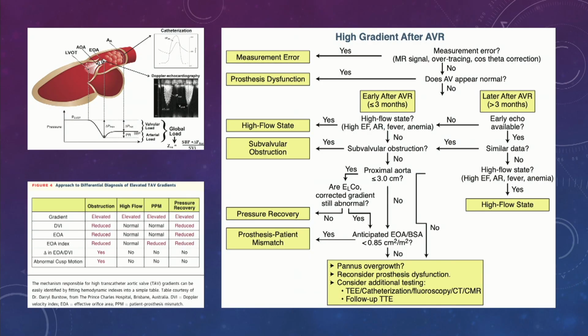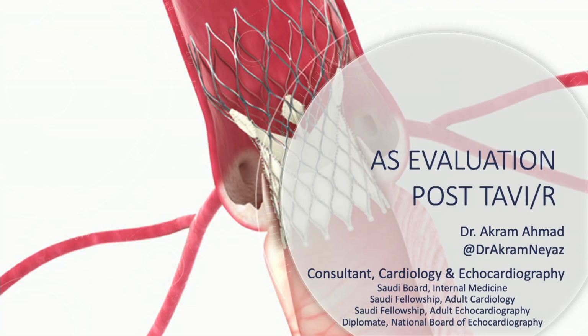In summary, this is a simplified algorithm that we can follow to go through patients who have high gradient after TAVR, not to miss any of the diagnosis. And thank you very much.